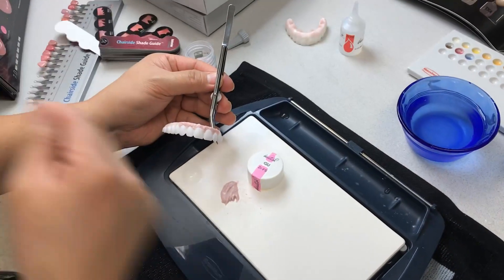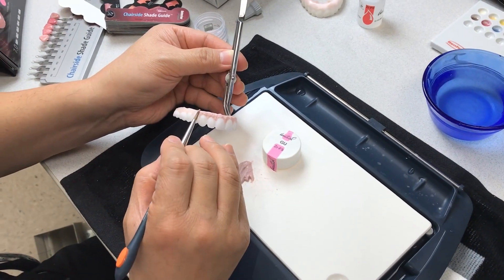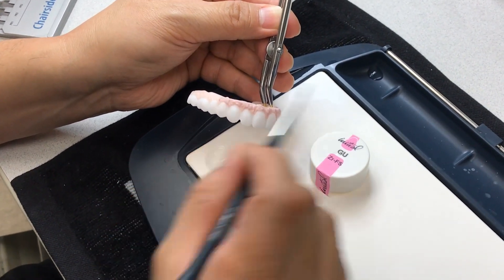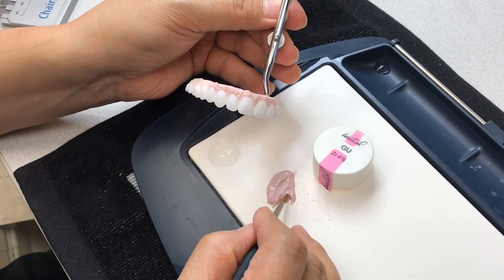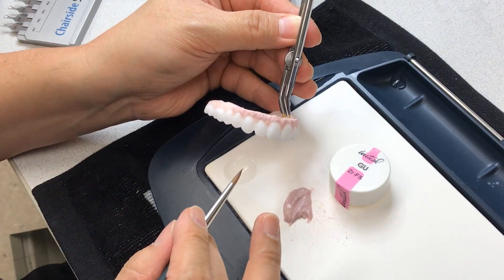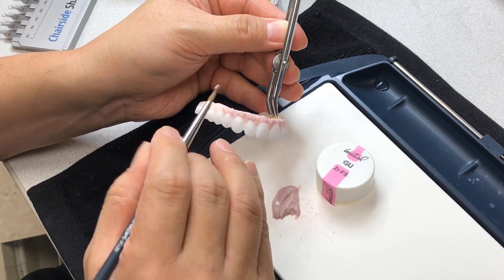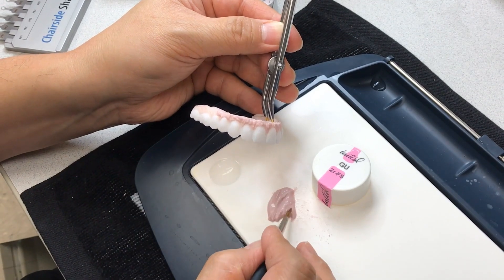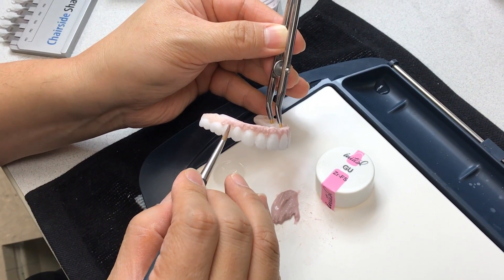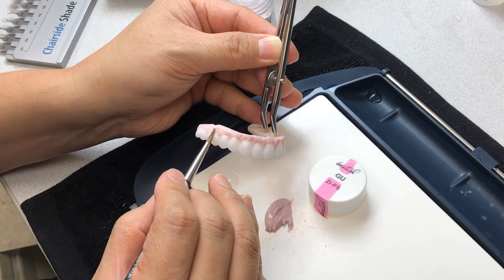Yeah, so you need the tool. You've got the paper shade guide and also the actual shade guide. But doctors — they cannot confuse porcelain and denture. Totally different animal. So sometimes we have to watch out for the materials in order to make the correct pink tissue color.